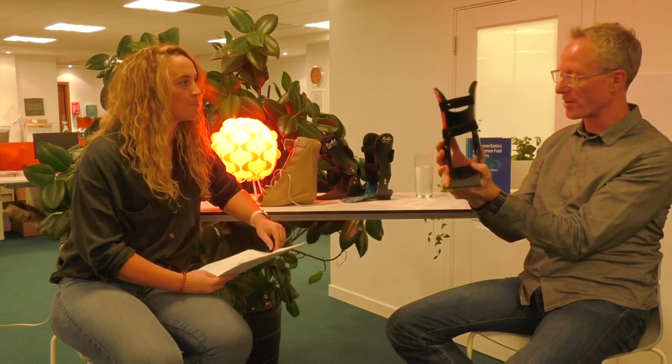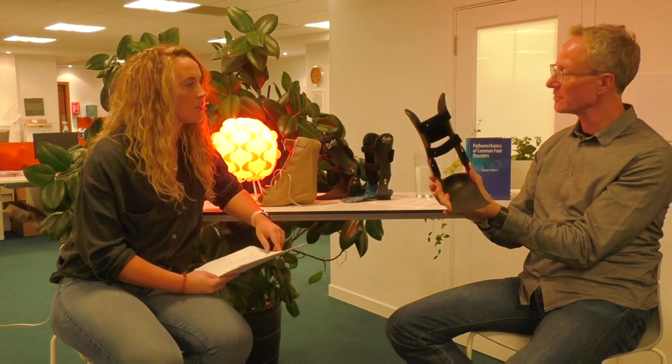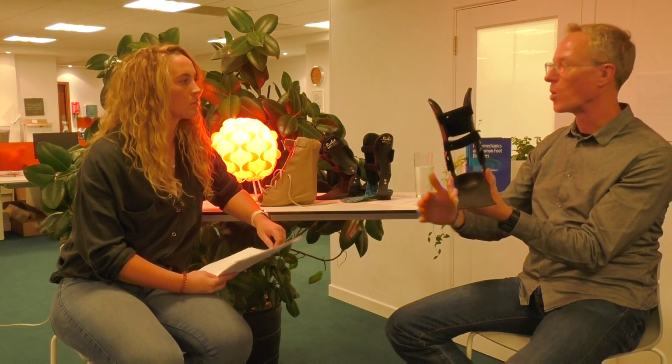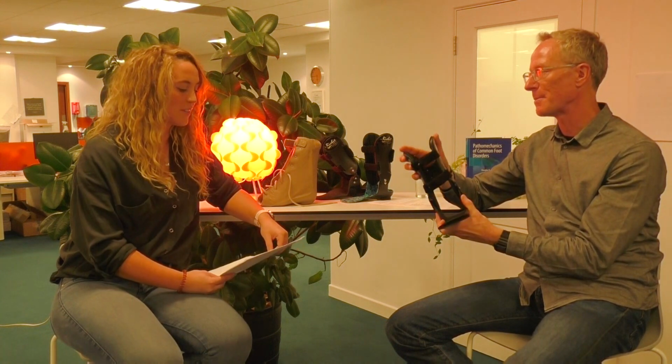It can be done. Normally what I would do is start with the standard device, and if it works really well for the patient and now they want to get more active, or it's a sports star who needs it, then you change the design. Perfect. And that's all the frequently asked questions.